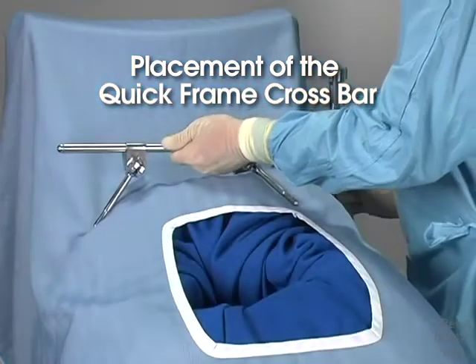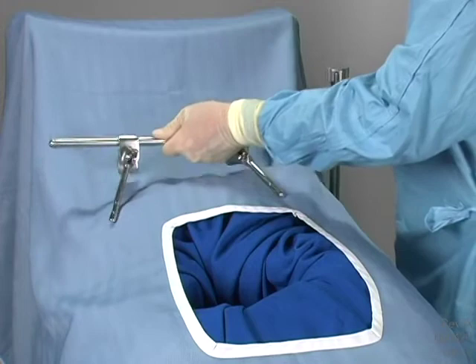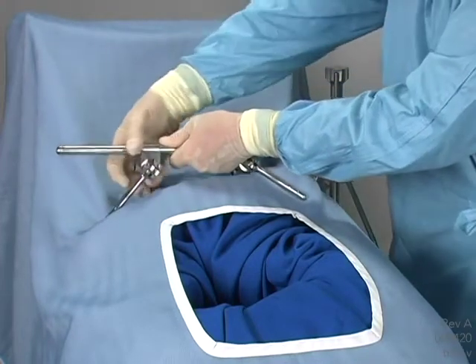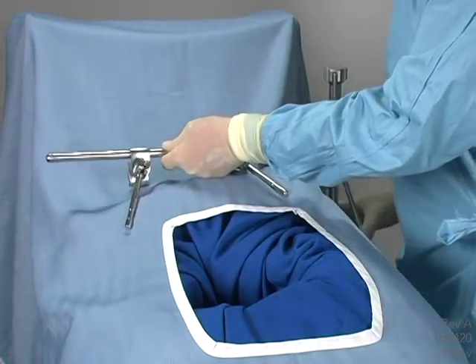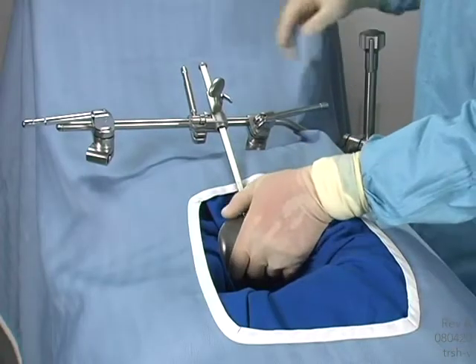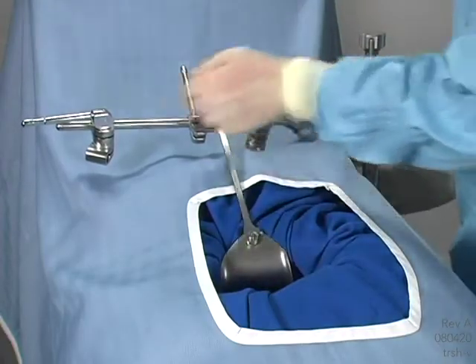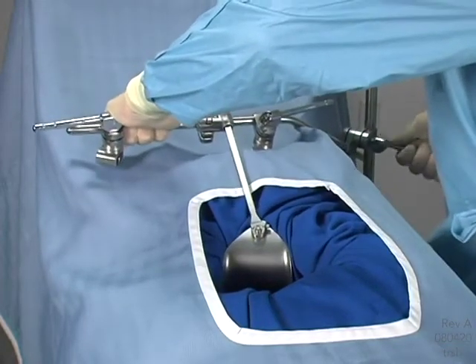Placement of the quick frame crossbar. Proper placement of the quick frame crossbar is essential to good retraction. There are two aspects to placement: distance from the incision and height above the patient. The crossbar should be placed approximately 6 to 8 inches away from the incision and just above the horizon of the patient, approximately 1 inch above the surface. To adjust the position, simply relax the tension or remove the retractors, grasp the crossbar, release the cam joint on the rail clamp, reposition, and lock back into place.